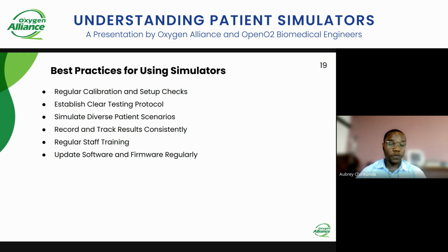The first one is to calibrate the patient simulators regularly and check before you conduct any test. You need to make sure that the patient monitor simulator is working properly. And after you've checked, you need to have standardized testing protocols for all the engineers or technicians, because in the case that you have multiple engineers or technicians at the site, you need to make sure that everyone knows the exact steps to take when they're trying to use the patient simulator.